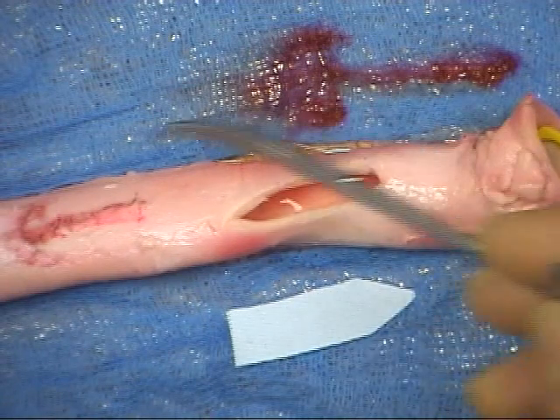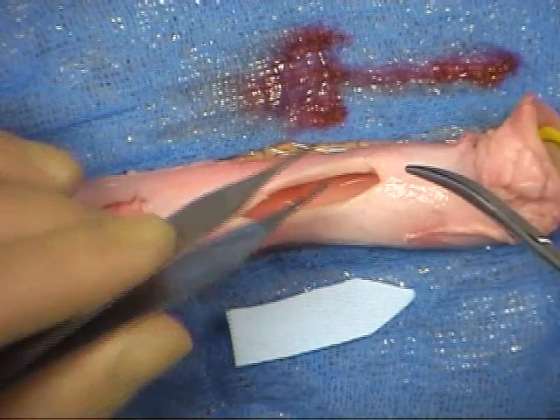In this example, we are assuming the blood would be flowing from right to left.